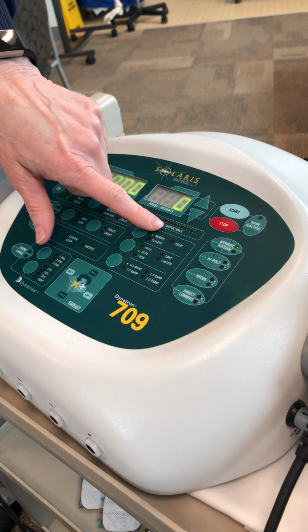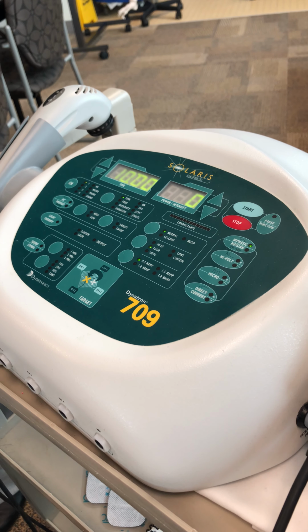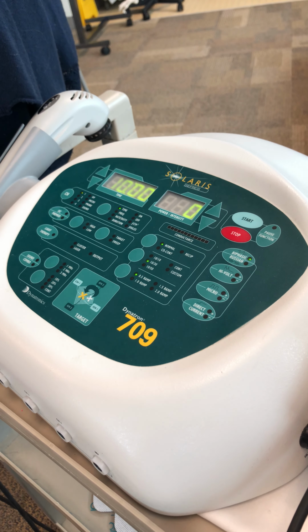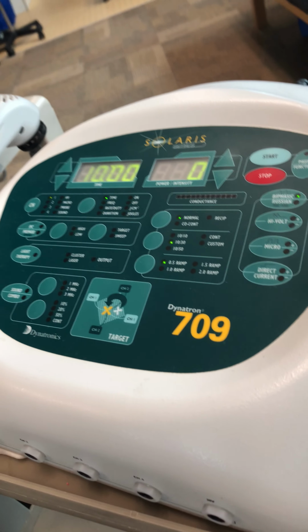Your first option is a type of contraction: normal, co-contraction, or reciprocal. In other words, do you want two opposing muscles working at the same time, which is co-contraction? Do you want them to alternate between muscles? We just want normal. We just want the biceps to work right now.